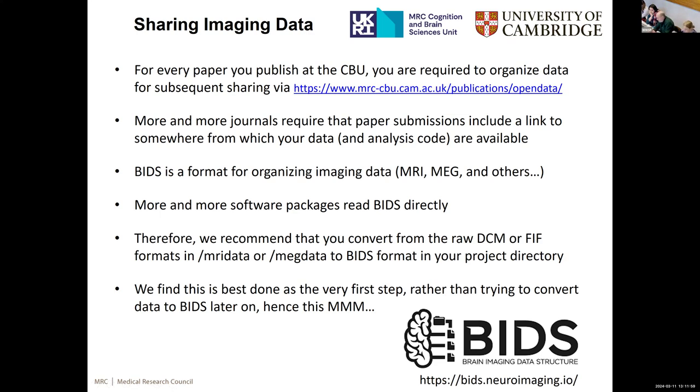Datsa and Mate have kindly put a lot of time into writing some pages on our wiki, or linked GitHub pages linked from our wiki, that walk you through how to convert the data into BIDS format. So that's going to go through the instructions she wrote a few months ago. But yeah, we owe thank you, Datsa and Mate, for doing this. Right, over to you, Datsa.